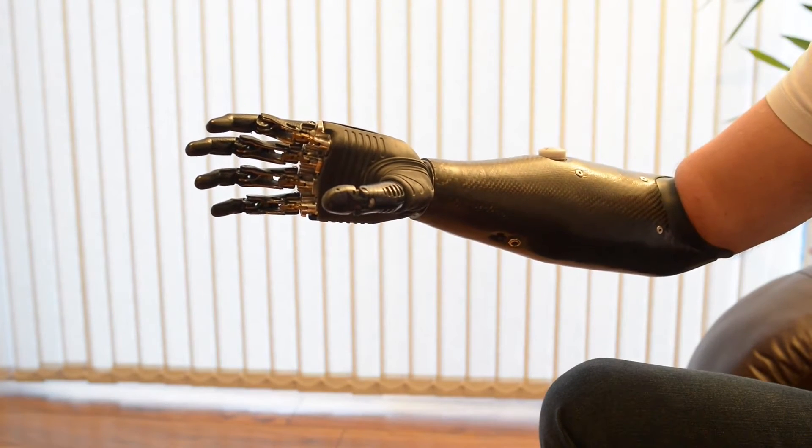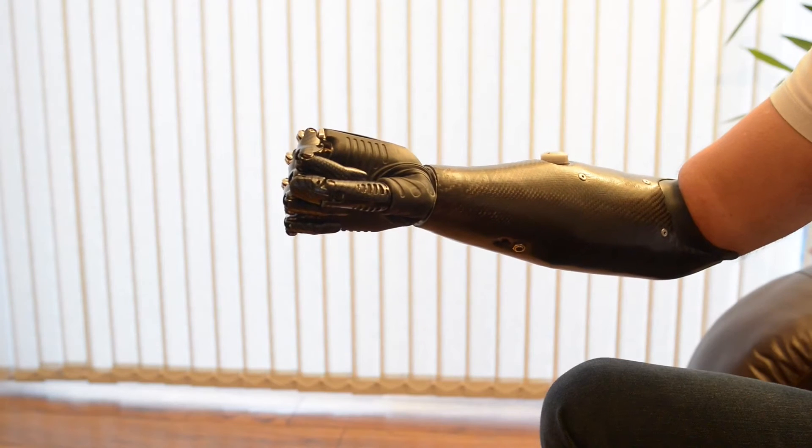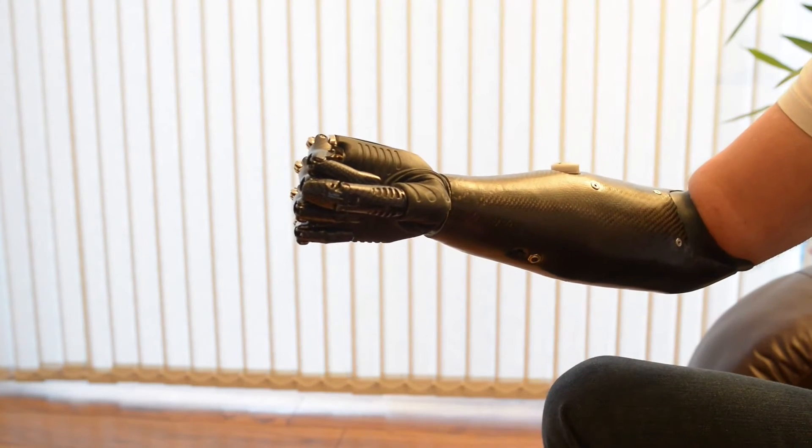We can then change the grip again. This is power grip — this is for heavy things. This is for shaking hands. This is for being human.